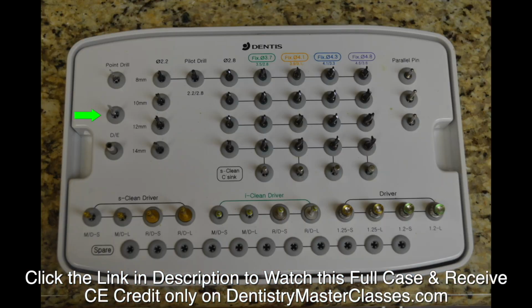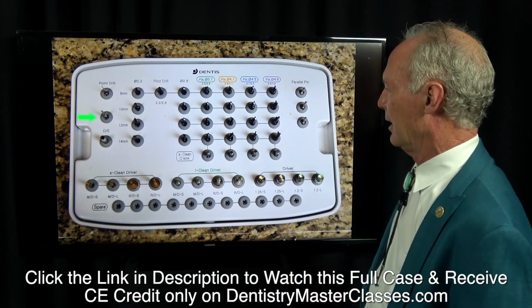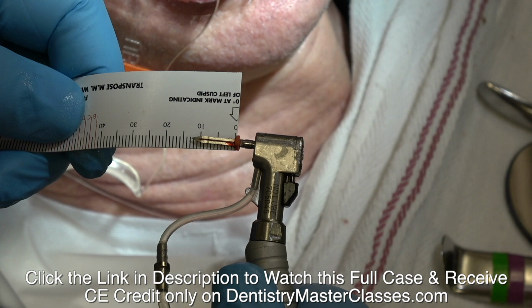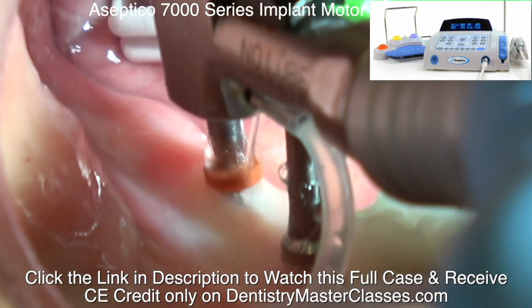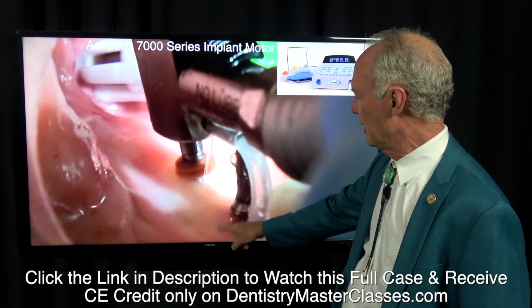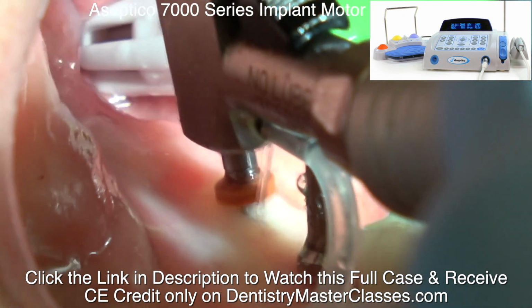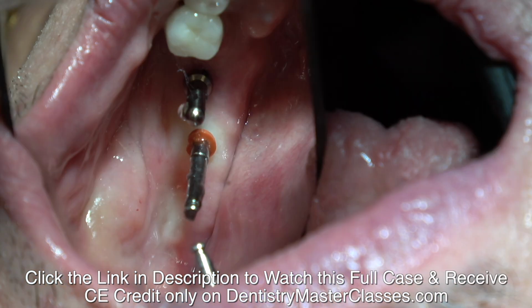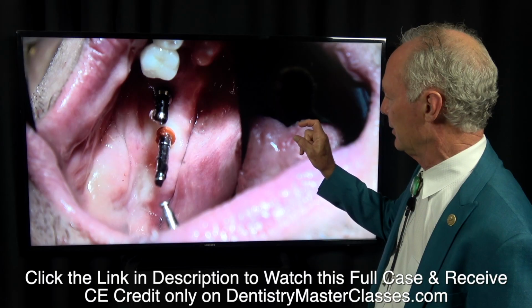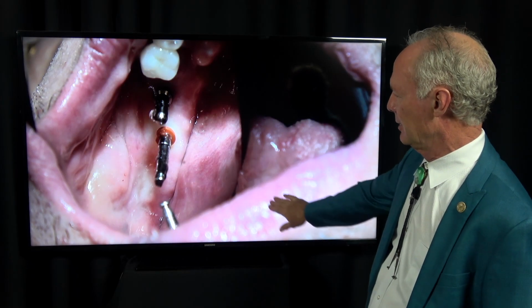So we've decided to use 12 to be very clear of the inferior alveolar nerve, and that was plenty. So this is a wider pilot drill. Now remember, this osteotomy is in the bone, but there's also 2 millimeters of soft tissue. So a 14 millimeter depth is going to give you 2 millimeters of tissue, and it's going to give you 12 millimeters of implant in the bone.